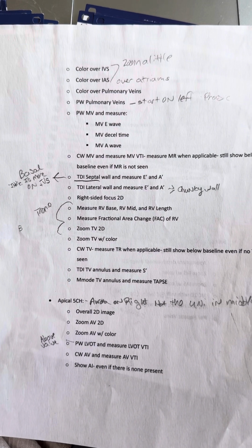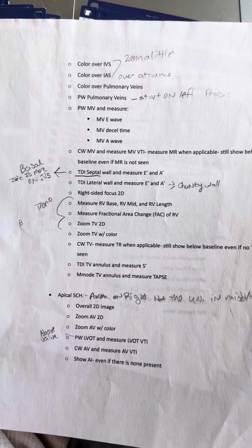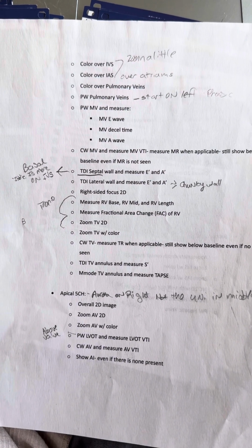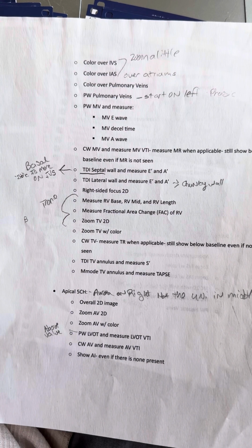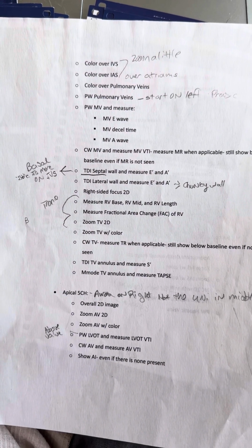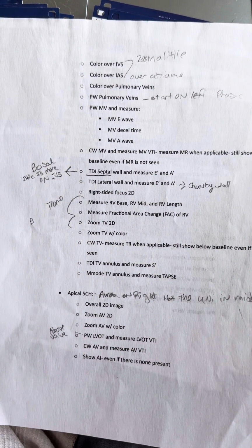We will then zoom a little bit over the IVS and color over the IVS and color over the IAS.